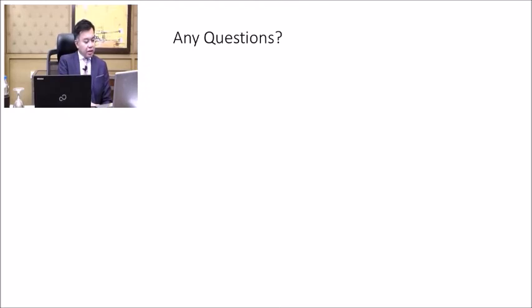Shroff Charity Eye Hospital asks, how dense amblyopia is conducive for Symphony lenses? I think that's an interesting question, and that's what you have to decide for yourself. My cut-off point is usually around 6/12, 0.5 decimal or 6/9. One way I've gotten around that is if they have different levels of amblyopia, I might place a monofocal lens in the very densely amblyopic eye and the Symphony in the better seeing eye.